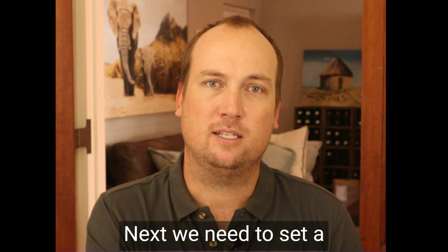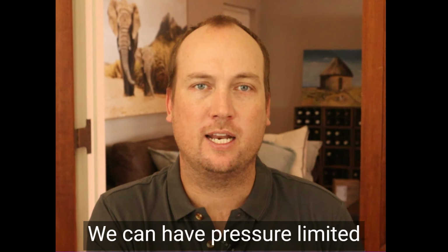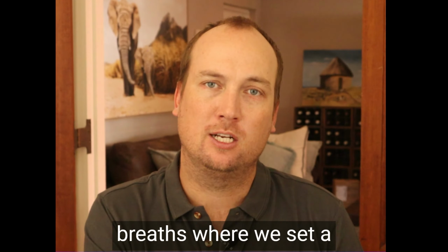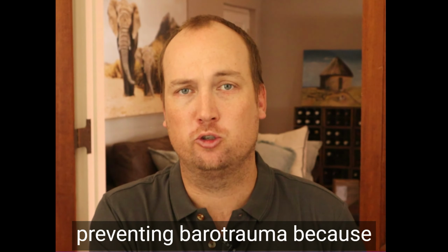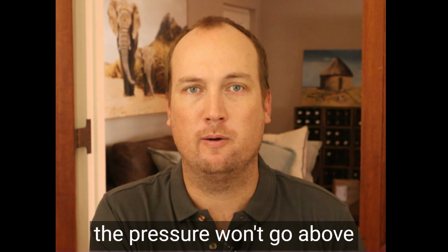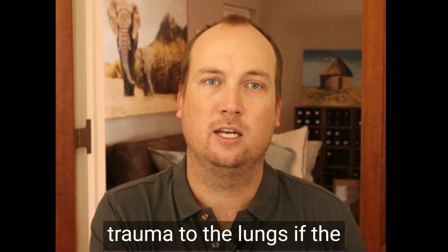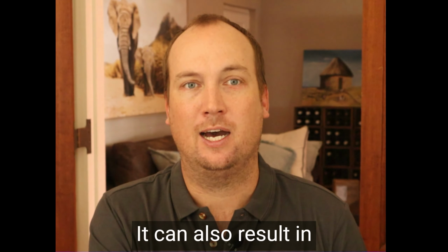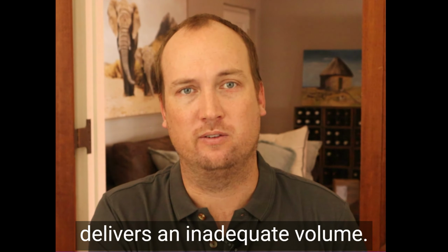Next, we need to set a target for the inspiratory phase of the ventilator, and we call this the limit. We can have pressure-limited breaths where we set a pressure limit for each breath, and this has the benefit of preventing barotrauma because the pressure won't go above the limit that we set, but it may still result in volume trauma to the lungs if the volume delivered is too large. It can also result in hypoventilation if the set pressure delivers an inadequate volume.